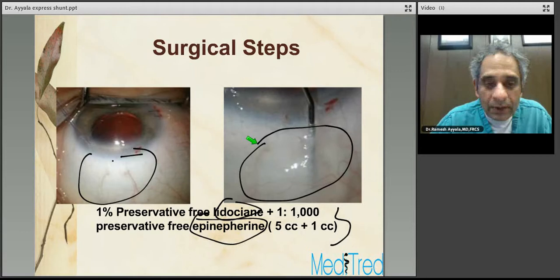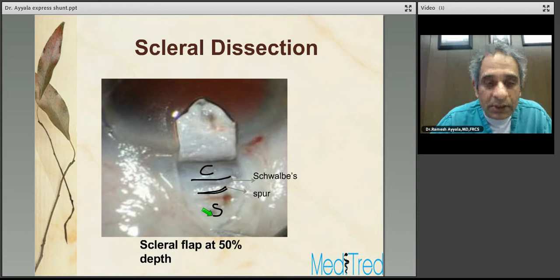Finish the conjunctival dissection with Westcott scissors, followed by scleral flap dissection. The thickness of the scleral flap should ideally be about 50% — if it's too thin, the Express faceplate can erode through it. As you complete the dissection, identify your anatomy: identify the scleral spur, Schwalbe's line, and the cornea. This anatomy is extremely important, and the critical point is that just anterior to the scleral spur is where you want to make your entry.